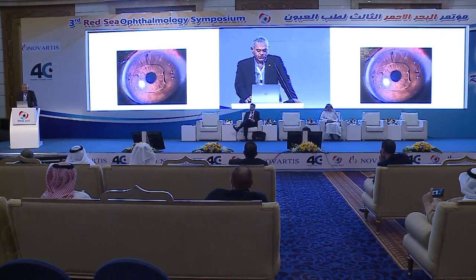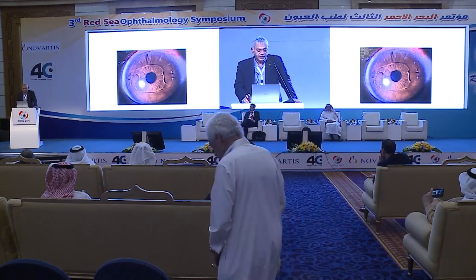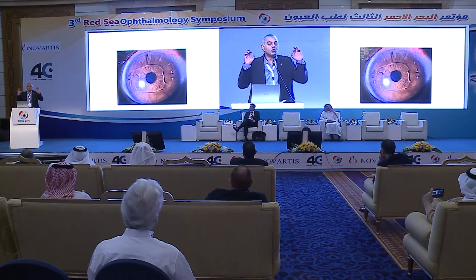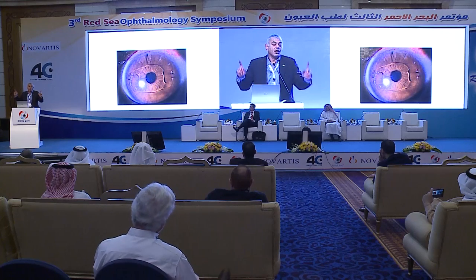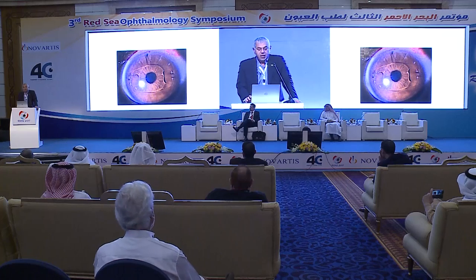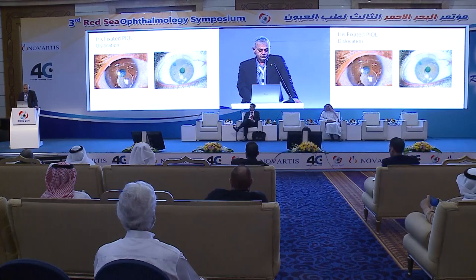for a lens exchange. For the Artisan lens, the iris fixated lenses, the good news is that the lens stays where you fix it for the rest of the patient's life, hopefully, because it does not rotate inside the eye. But what might happen, and I've seen this in quite a good number of patients, if you have a poor enclavation, then this lens may dislocate inside the eye, like in these cases, and this is a very serious condition. You need to remove the lens immediately and either reposition it or exchange it.